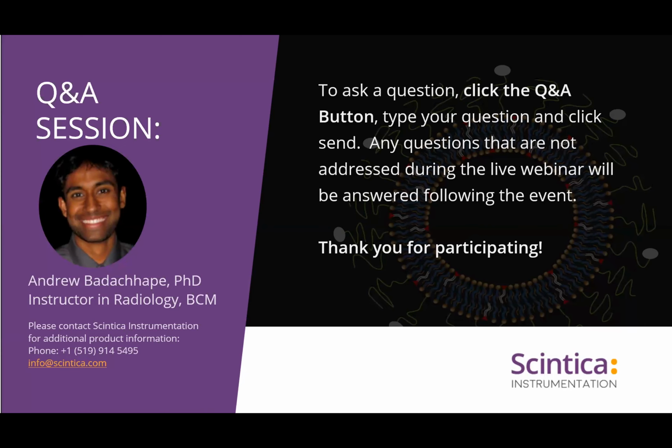That's a great question. The primary difference that we have with lower field strength is obviously signal quality. At lower field strengths, you are not going to be able to visualize and have as much signal resolution as you're going to have at higher field strength systems. And a big point as well is that you're also able to use a lot more complicated and fancier sequences than we're often using. Diffusion weighted imaging sequence, DTI, a lot of other sequences that allow you to get additional information about the target system or the features of interest.